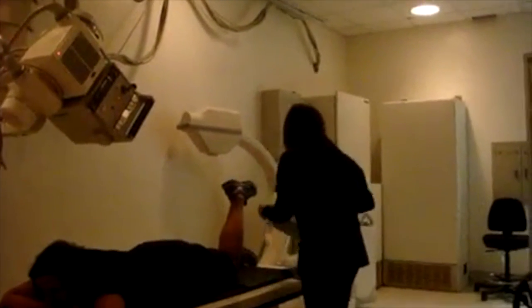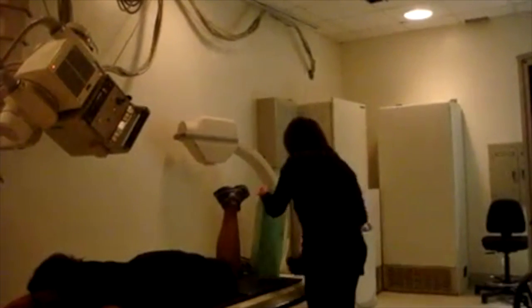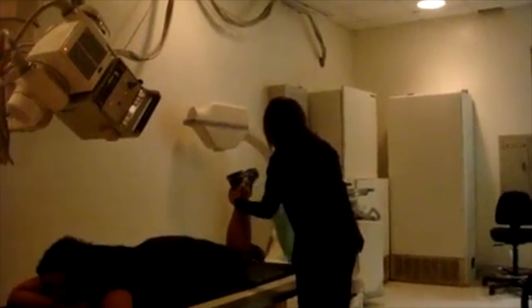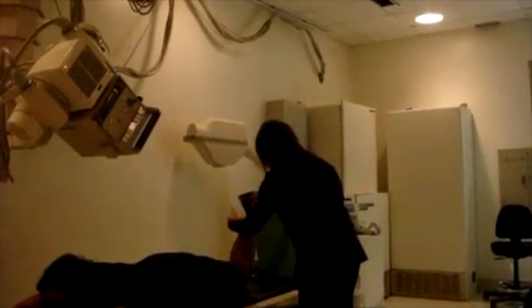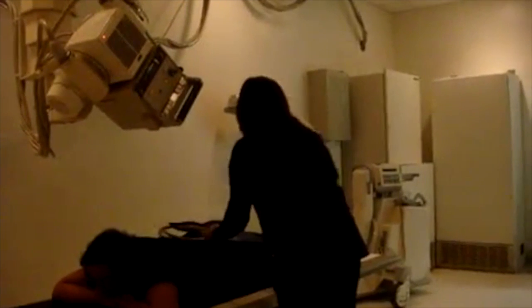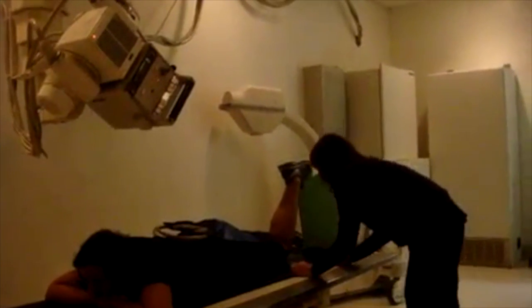I'm going to give my patient some support for the foot. The foot is going to be at a 40-degree angle, as well as my central ray and my tube. My source image distance is 40 inches. I'm aiming for the midpoint of the intercondylar fossa. Got my shield. My right marker goes in the light field.